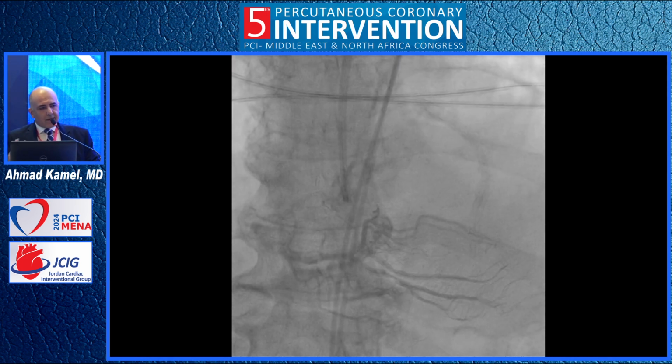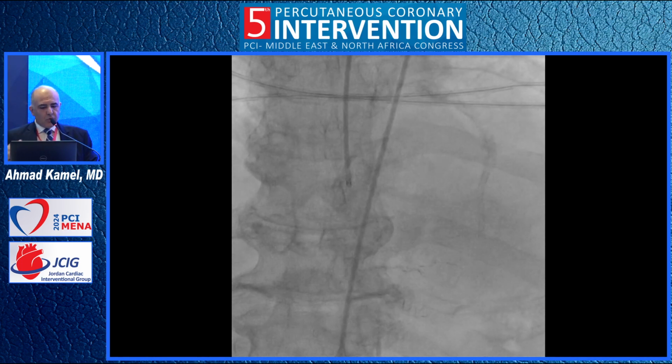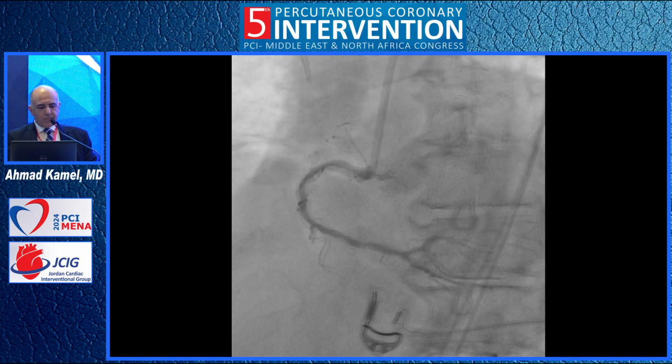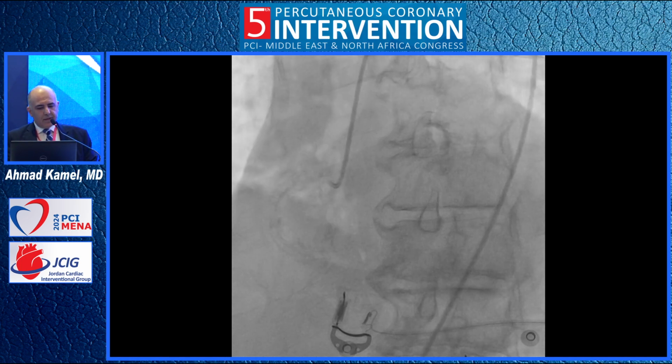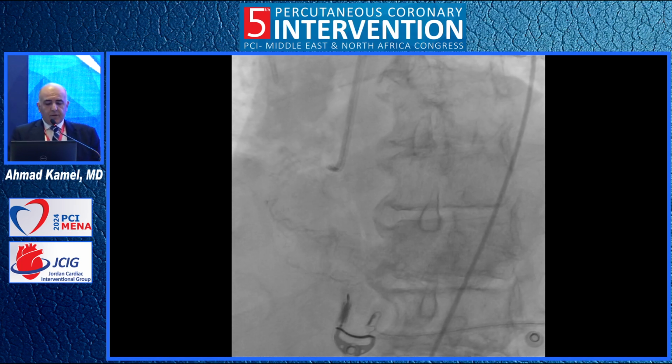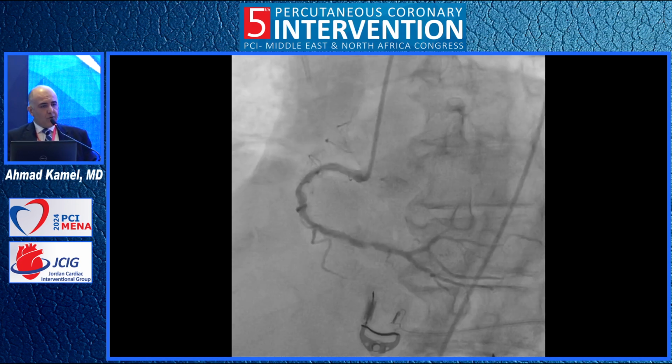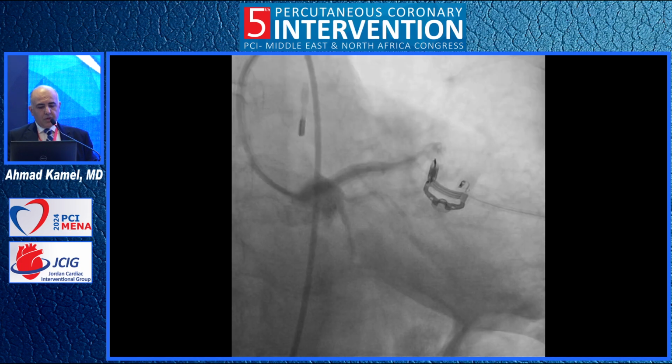The right coronary artery, actually, we didn't tackle in the first procedure, but we wanted to see what's going on. So this is the right coronary artery. It's the same as it was before. We didn't treat it in the first procedure. And this is the LAD. I think the flow is better. We have maybe TIMI 3 flow.